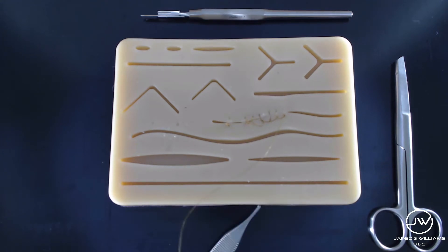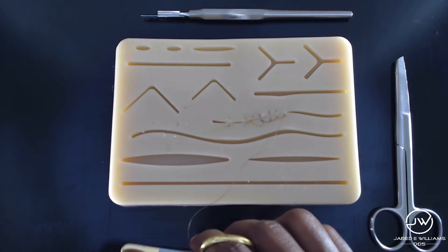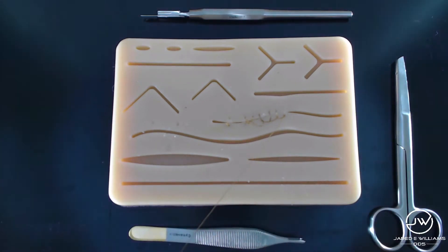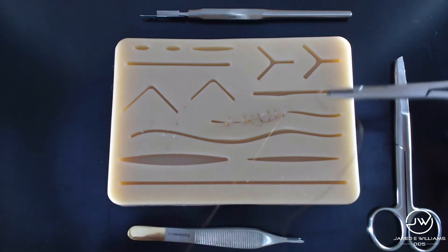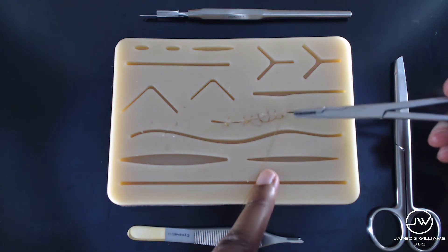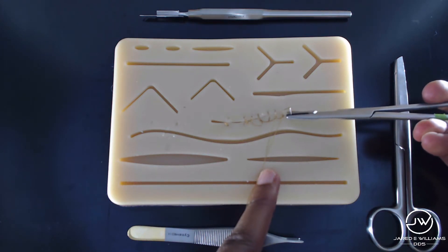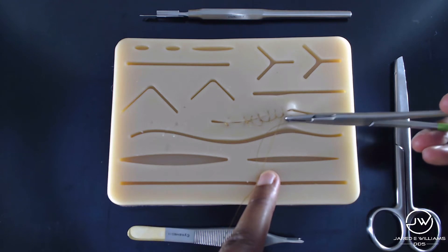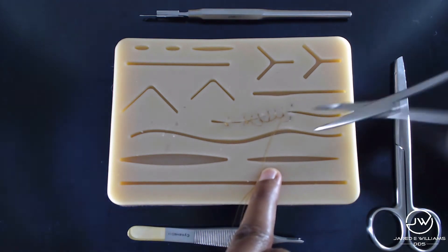Now, we're going to go ahead and wrap this up of this continuous suture. Because you can't just leave it like that and let the patient go. So, what you're going to do is this. I'm pretty sure you're asking me, well, there's no tail. Well, you're very intelligent because those are the best questions. What we're going to do is this. We're going to go ahead and start the process again. Get a nice bite of tissue.